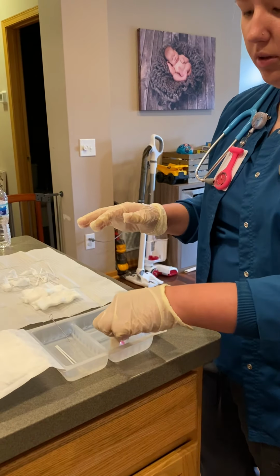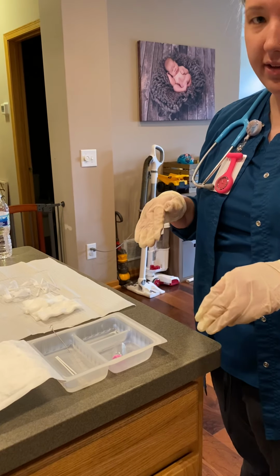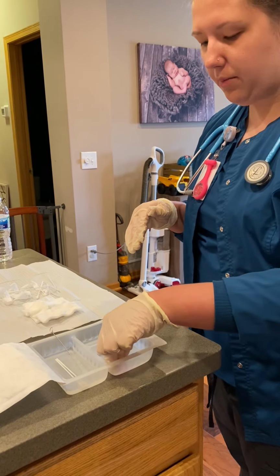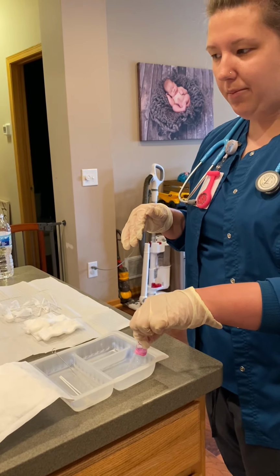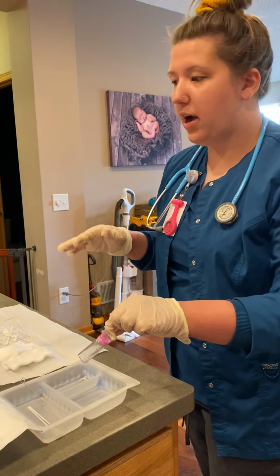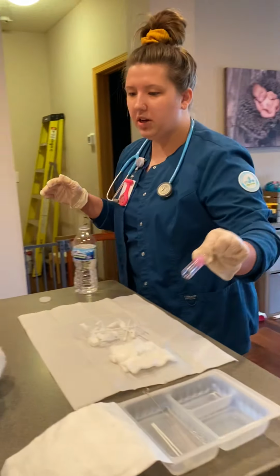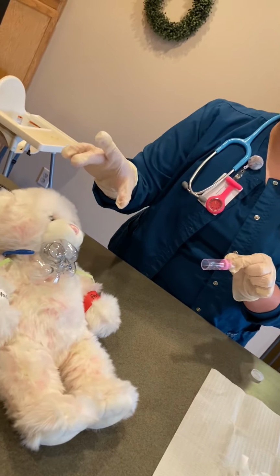And then I'm going to rinse it off in this compartment that's just saline to ensure that all the peroxide came off. So now that I did that, I'm just gonna still grab the top part, and I'm going to knock it off the side so that I can keep it dry. And I also would have ensured that the patient had the oxygen back on. I would have replaced this back when I was doing this.